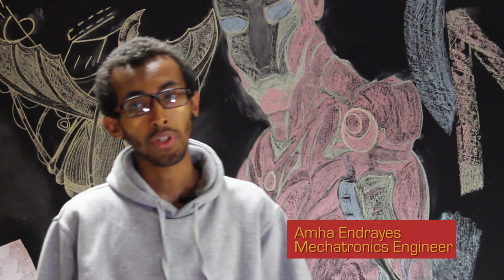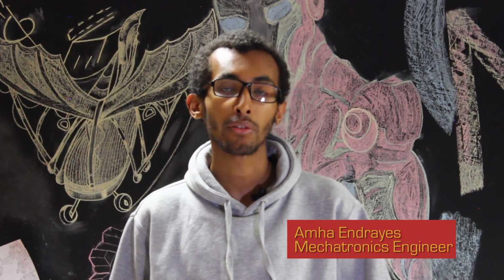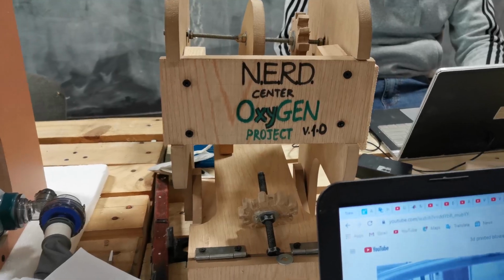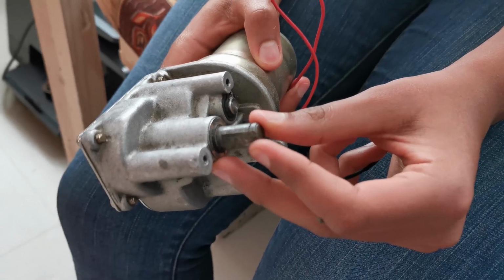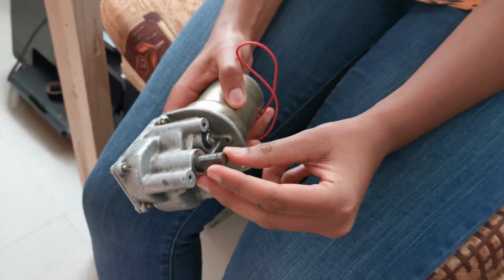Due to design constraints and limited material resources, we mainly used MDF, which is a wood material, and foam board. We chose these materials because they are locally available and they can be sanitized during medical operation. But in time, we're planning to use more optimal and medically graded materials.